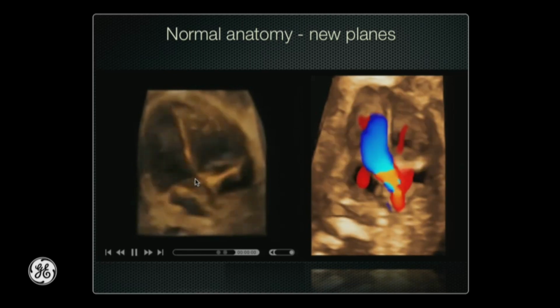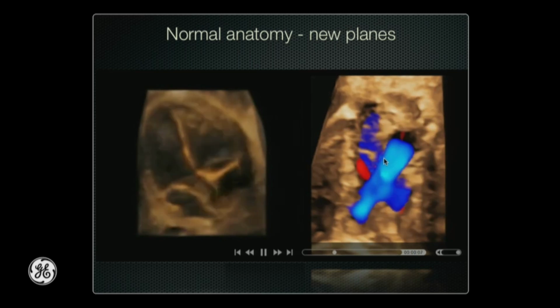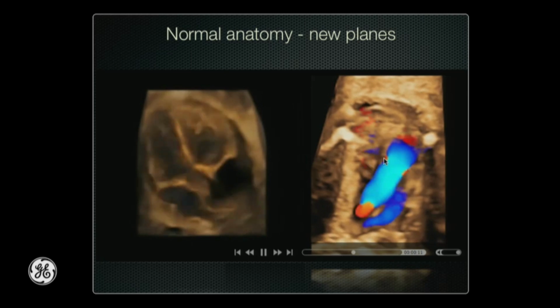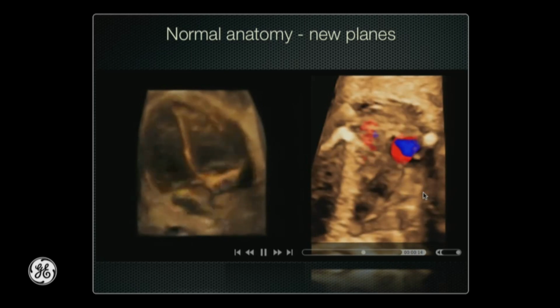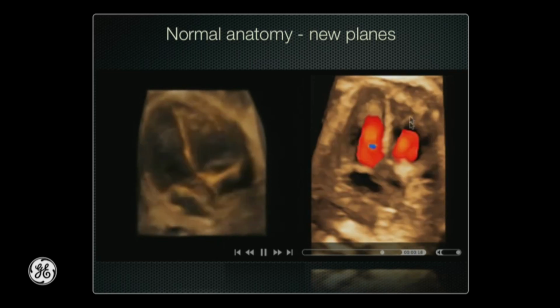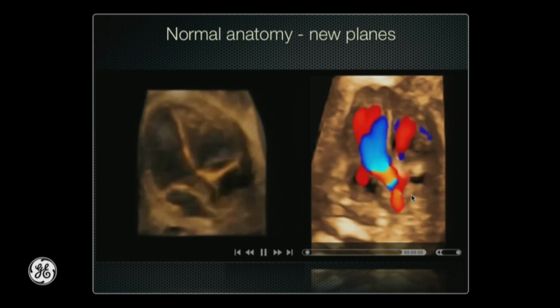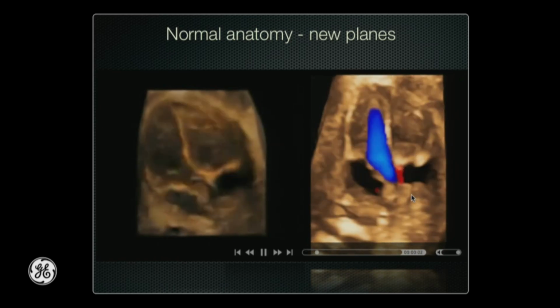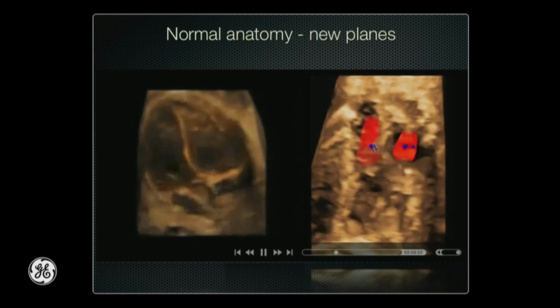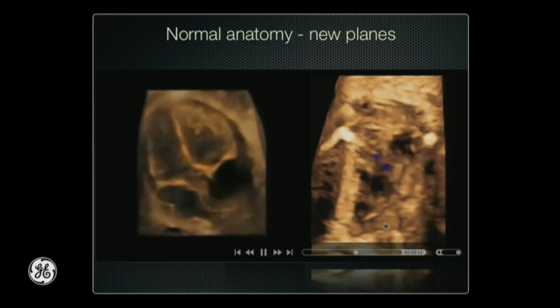And with normal surface mode, you see the aorta, and using the combination of grayscale and color Doppler information, you get glass body mode volume, and you see the blood flow. When you scroll through this volume, you understand the diastolic filling of the ventricles, the left ventricular outflow tract, and the overcrossing of the vessels. And it's very good to understand the position of the vessels to each other, the aorta going to the right and going back to the left as an aortic arch.